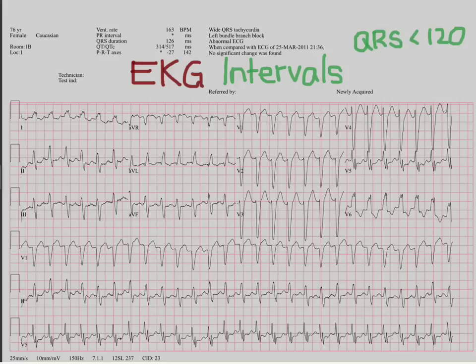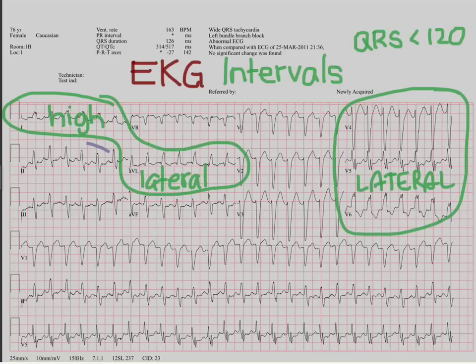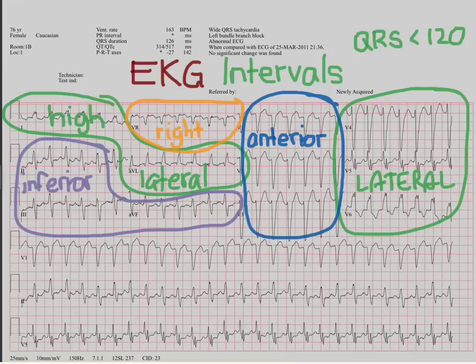So let's come back to the EKG. Which ones are the lateral leads? Well, it was 1 and AVL, and also V4, V5, V6. And the inferior ones were these, 2, 3, and F. And the anterior ones were these here, V1, V2, V3. And AVR kind of looks at the right side. So remember this. We're going to use this when we look at MIs as well. But now let's get back to the bundle branches.